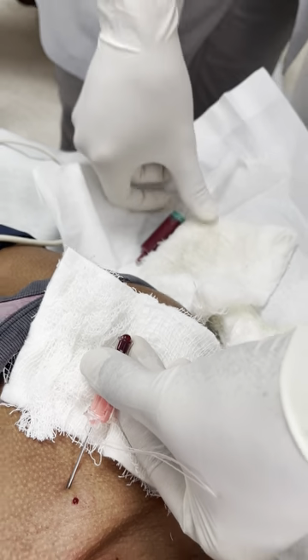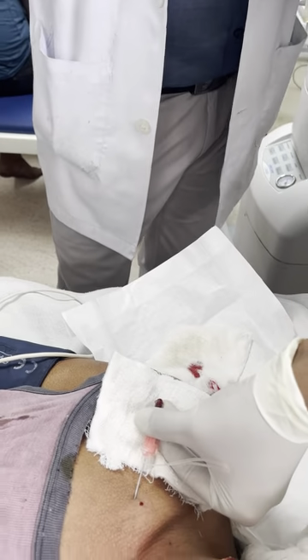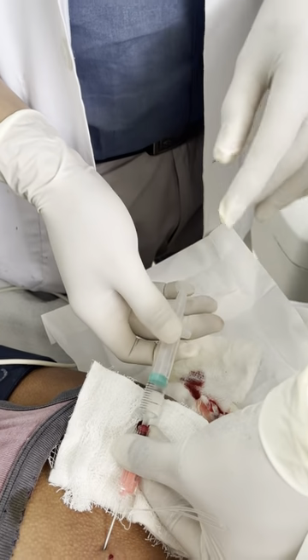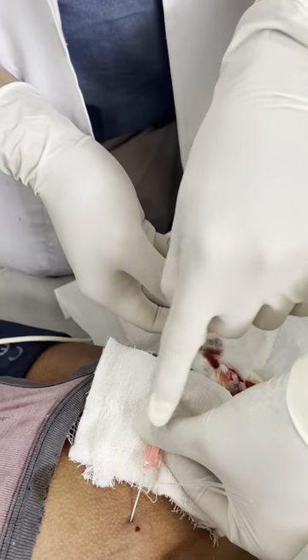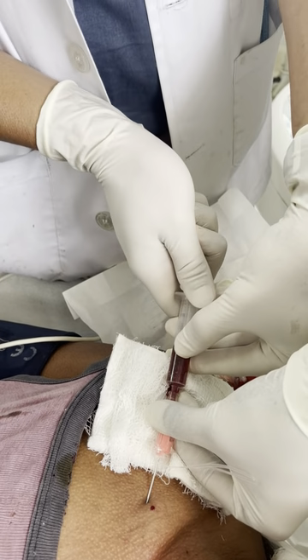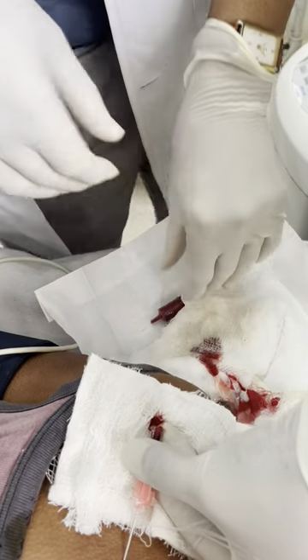So to confirm it again, what will you do? You will dilute it with your assistant, like me, and you will check it again. You will hold it. Don't allow it to move in or out. You will check the flow again. It is for damn sure that we are in the vein.